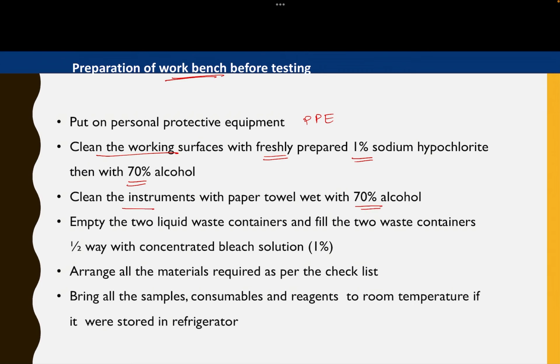I'll talk more about this in our maintenance log, when you have to do this particular thing. So please don't use sodium hypochlorite for instruments. Sodium hypochlorite should not be used for instruments because, as I told you, it is corrosive, and if it comes into contact with any metal part, it will corrode and can damage your machine.